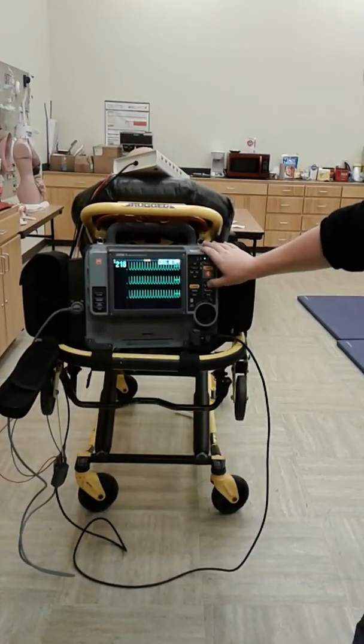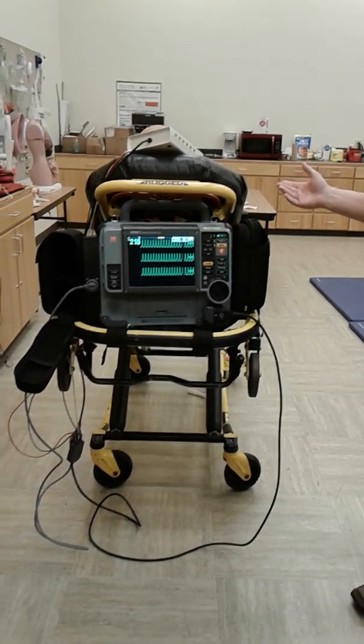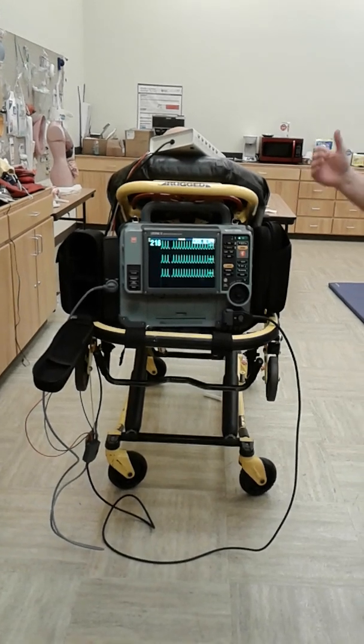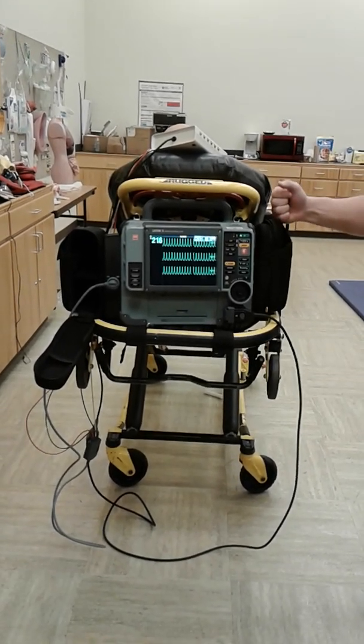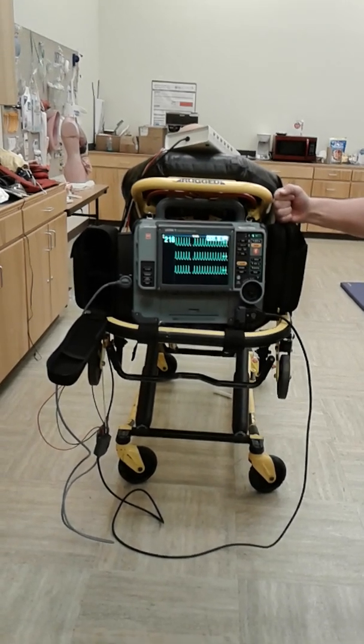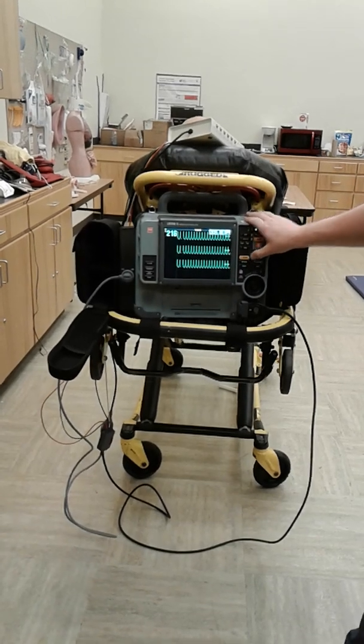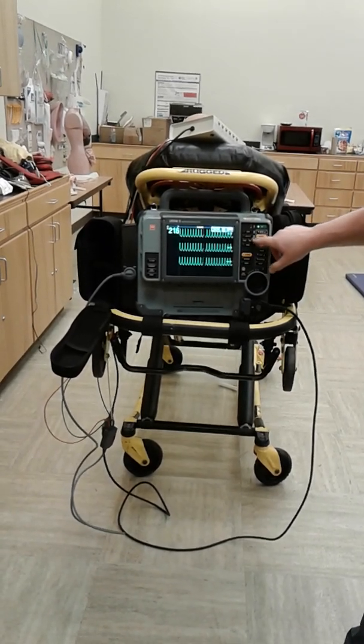So if this patient is presented with chest pain, shortness of breath, altered mental status, we're going to bypass giving them meds, and we're going to go straight to cardiovert. American Heart says if they are unstable, symptomatic, we can go straight to electrical therapy. Okay. So we come in here, we hit sync.